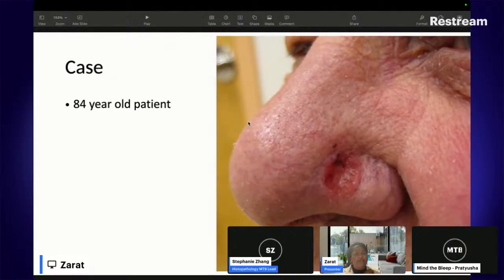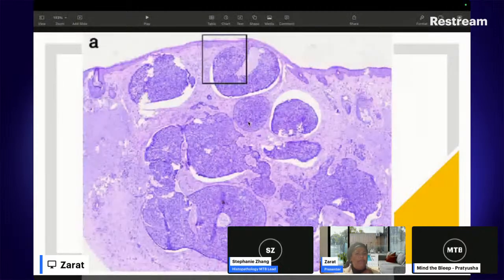But again, I don't think we're able to, because I can't see the comments. So it's something you've seen before. So I'll give you maybe a minute to write down what you think. It's one of the conditions we have just seen. But I'll just say the keratin layer is fine. The abnormality seems to be in the dermis. There is some sun damage here and here. And then you see these large lobules of very blue cells, so very blue purple cells. So if you can just commit to a diagnosis.